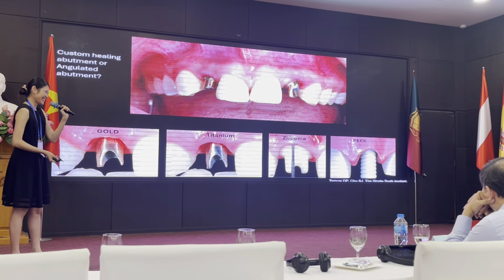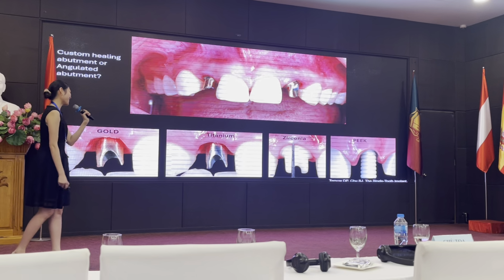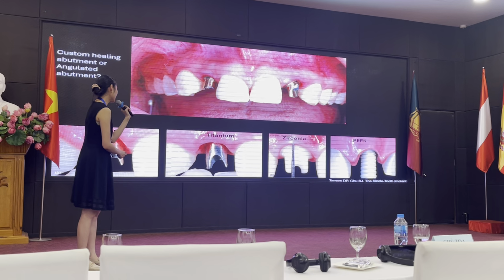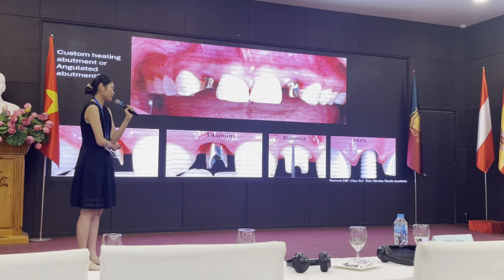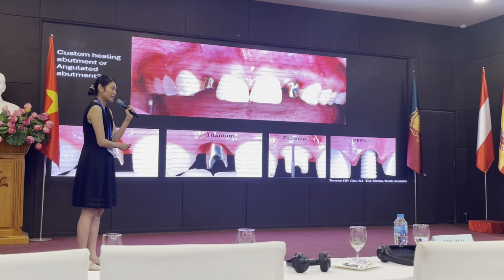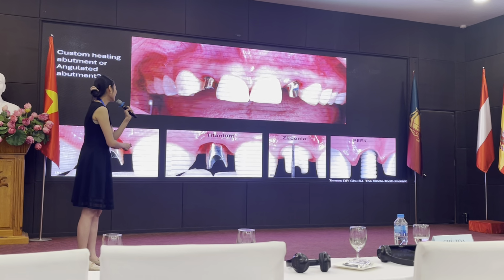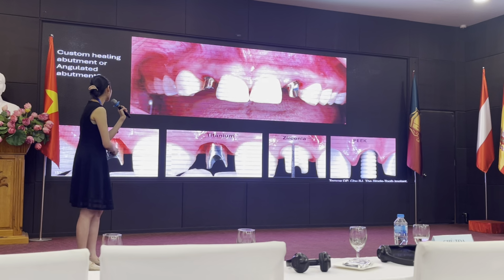And then I graduated, so I transferred this case down to my co-resident. That is how it happens at school. And then this was a photo that my co-resident sent to me. So here what we see is we have a custom gold-plated abutment here, and the angulation is still buccal. And here you can see that we place our margin right slightly below the future gingival margin.